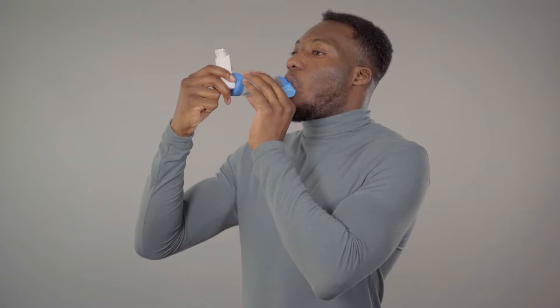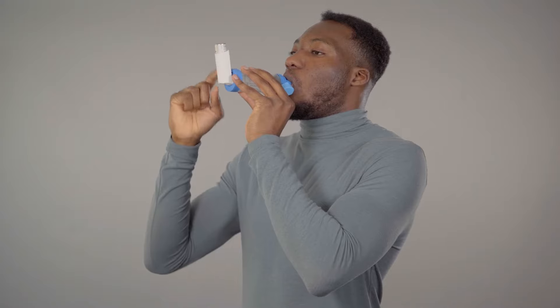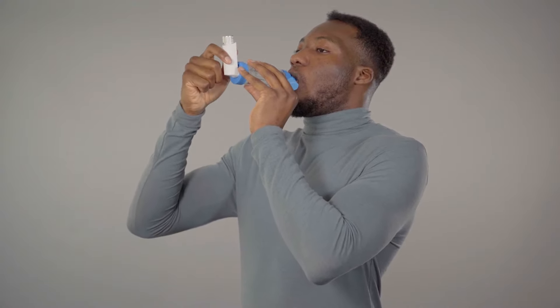Sit or stand up straight and slightly tilt your chin up, as it helps the medicine reach your lungs. The next steps all happen smoothly in one action. Put your lips around the mouthpiece of the spacer to make a tight seal. Press the canister on the inhaler once to release the medicine, and breathe in and out slowly and steadily into the spacer 5 times.